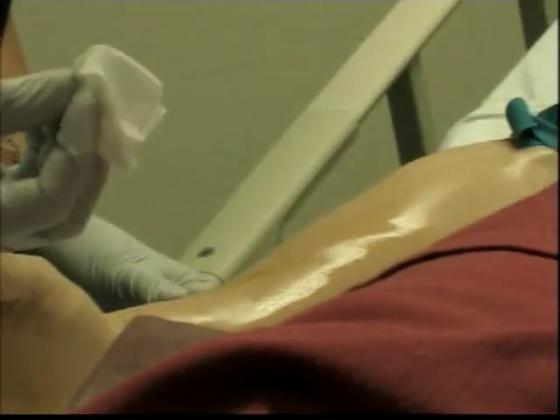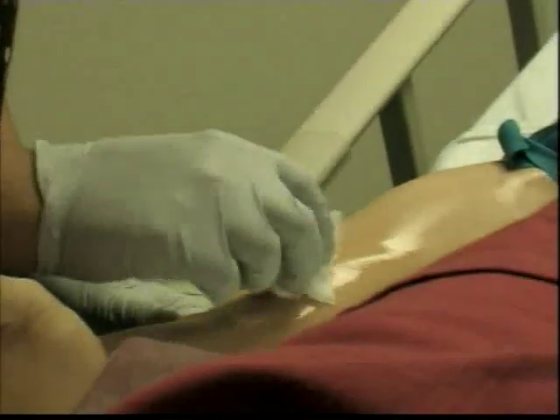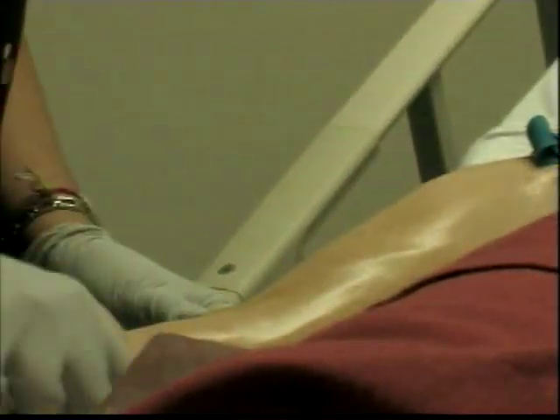If you have too much of the alcohol or their solution, you can use the gauze that's inside there and remove the excess. We don't fan, we don't blow on it, and we clean it. And then we're ready to make sure that you anchor the vein.